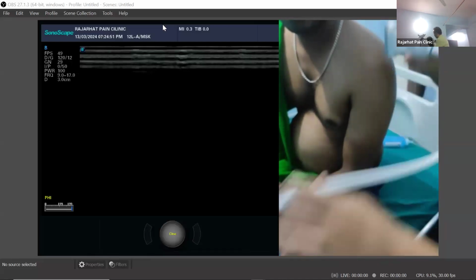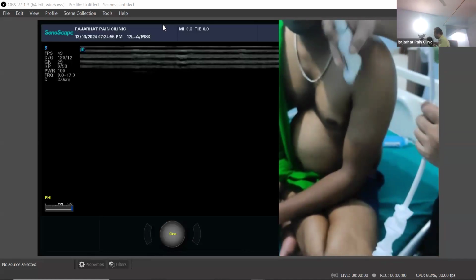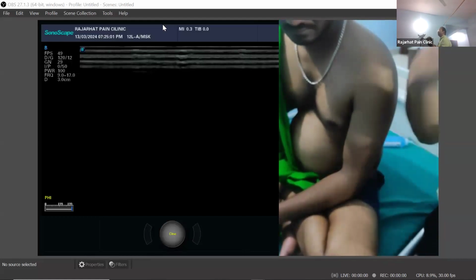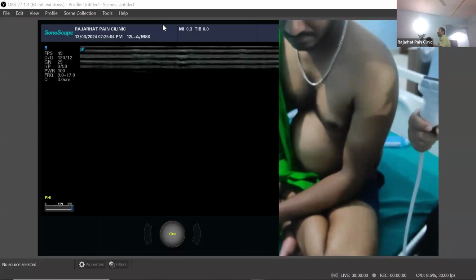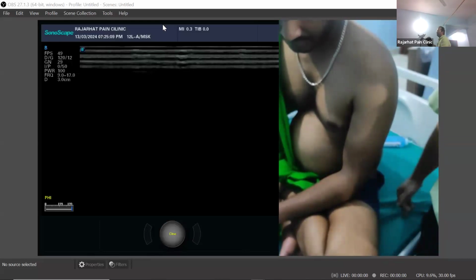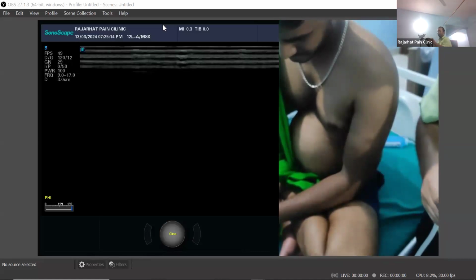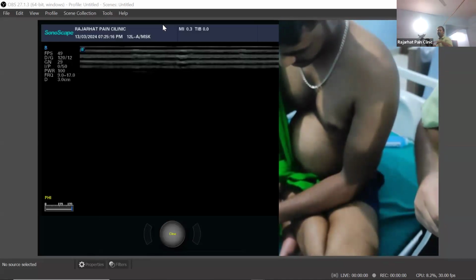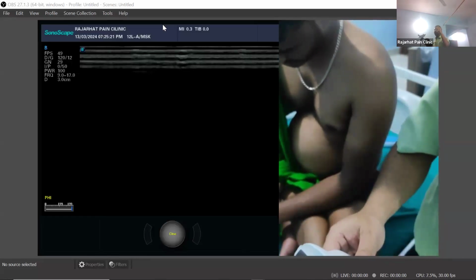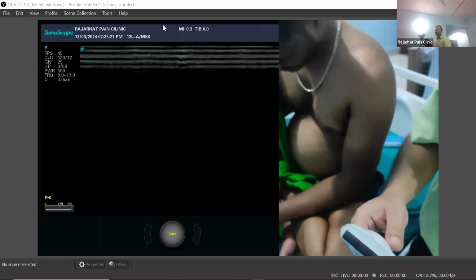I can keep this side on the medial side of the patient, or on the lateral side, or on the cranial side. This is up to me. But, as I told you, these are all axial cross sections. Whatever way you are seeing it, these are all cross sections. And when you know whether you are seeing from medial to lateral, lateral to medial, or cranial to caudal, you can make a 3D reconstruction in your brain of how the inside structures are oriented.